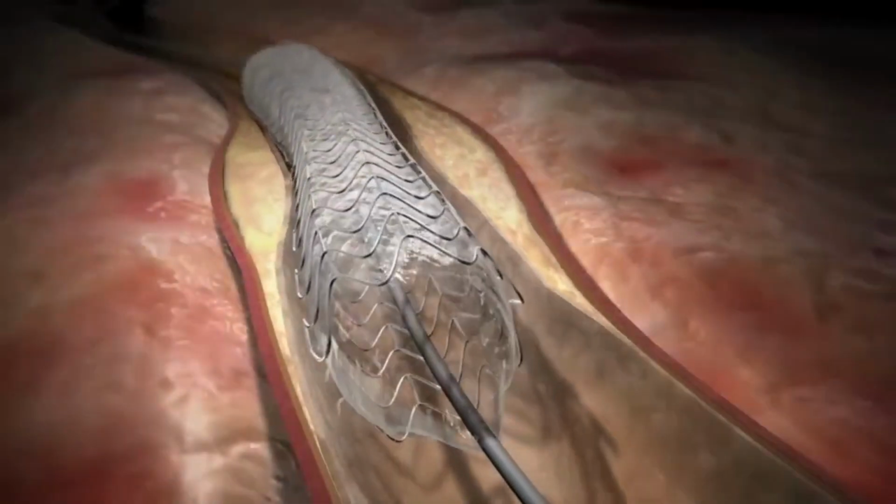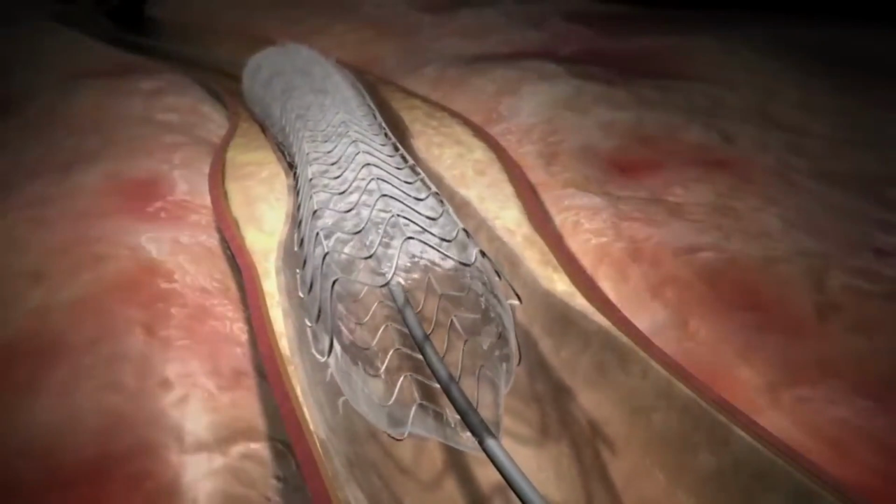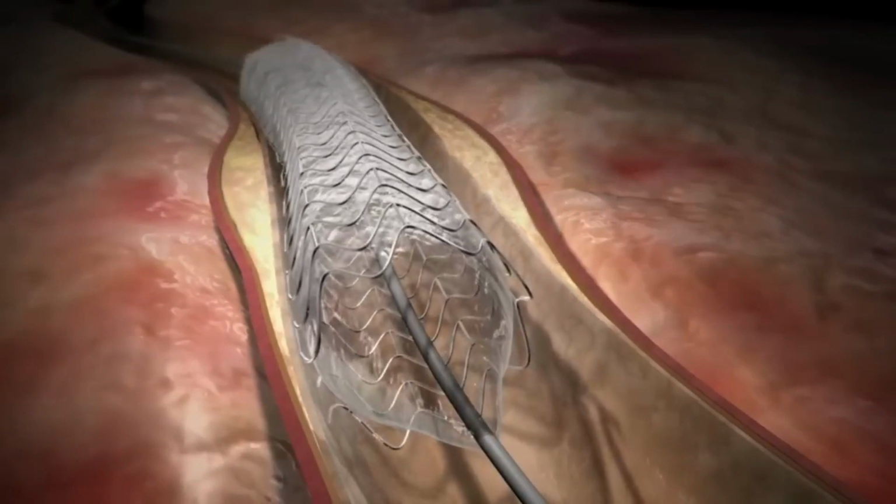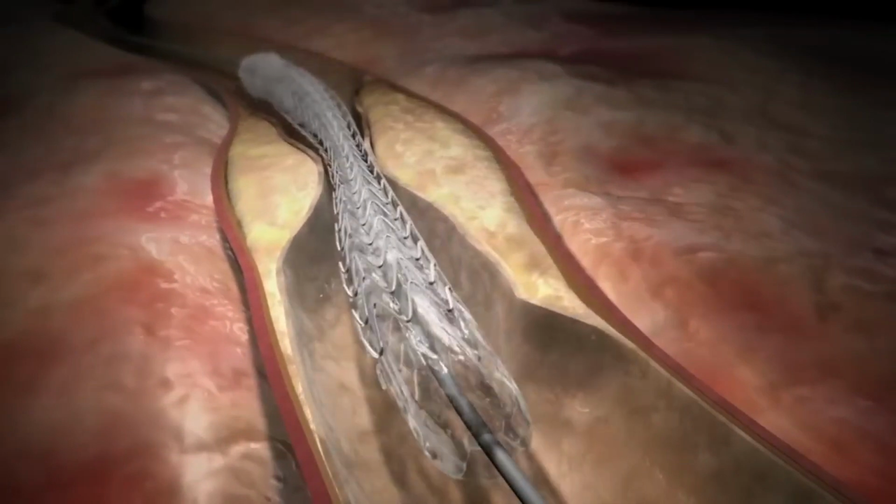Then your doctor will inject a small amount of X-ray dye through the catheter. The patient may feel warm flushing at this time. The dye will enter the coronary arteries. The blockage will be found through X-ray.